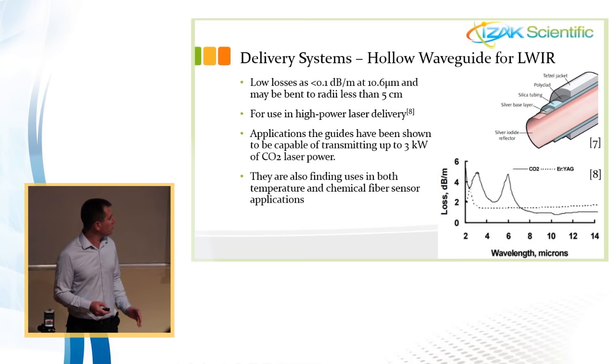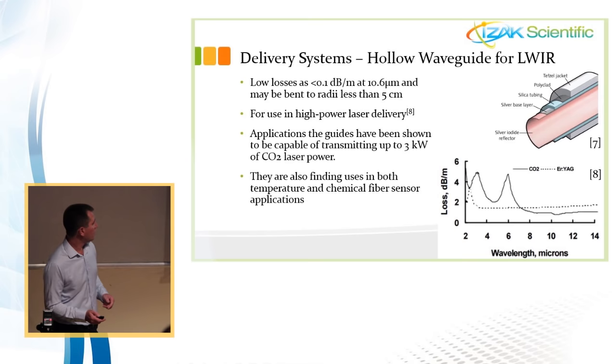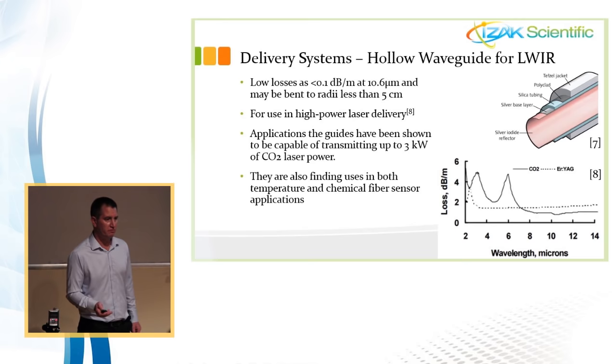transmission, or fewer losses, with this. Currently it's used in robotic applications for surgery, I mean like the Da Vinci robot. It also opens up the use of a CO2 laser for a lot of other applications with this waveguide, which can be bent.